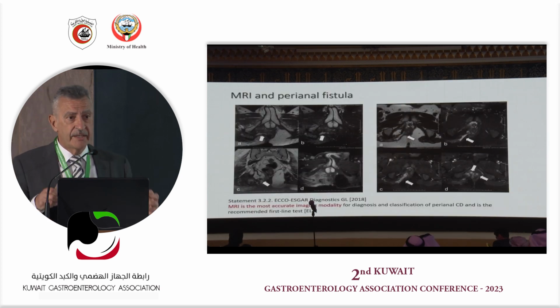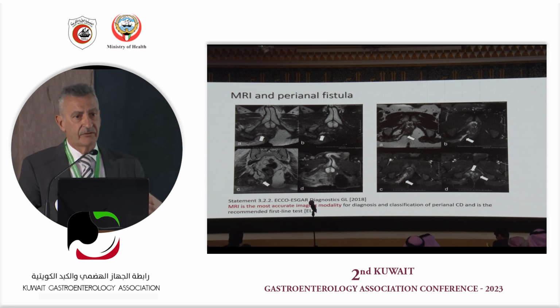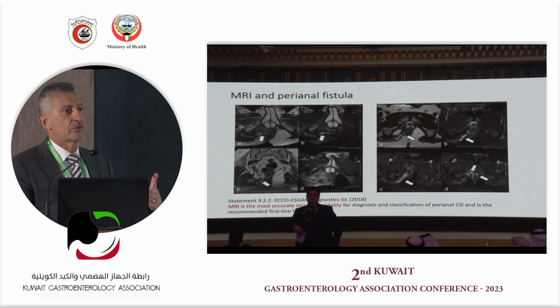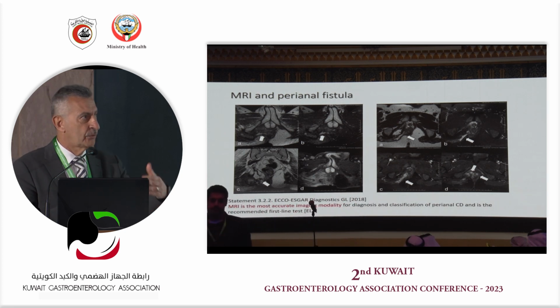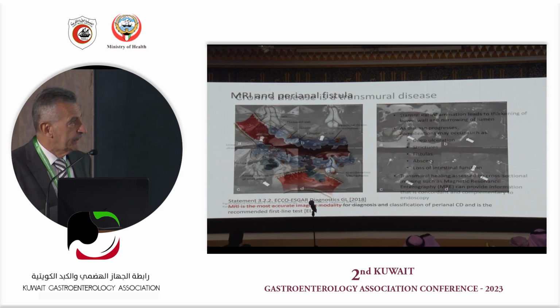Now, probably the great beauty of MRI compared to all the other methodologies, compared to CT scan and ultrasound, is the evaluation of the pelvis, in terms of the evaluation of perianal fistula. This is the standard of care in terms of evaluation, it is the most accurate imaging modality, and it is the best way also to follow up the patient. For ultrasound, a kind of perianal ultrasound can be done externally, but it cannot be as deep and as topographically defined as MRI. So that's the way to do it.